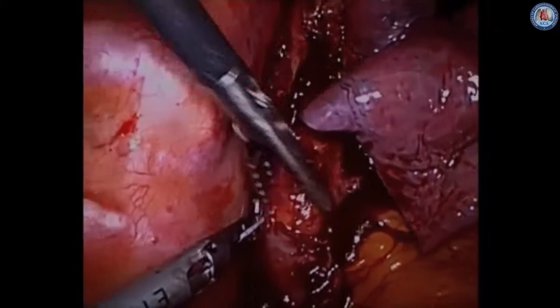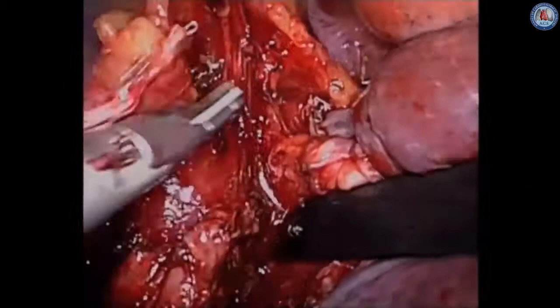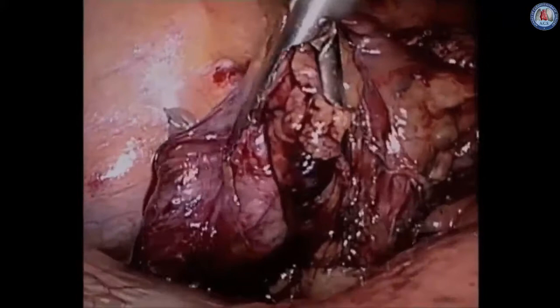We will at times clip many of these branches. The harmonic scalpel works well as well. We extend this all the way up to the thoracic inlet, above the level of the azygous vein. We try to keep a pleural tent which can ultimately cover the anastomosis. We try to extend this as high as possible, making sure to protect the airway.